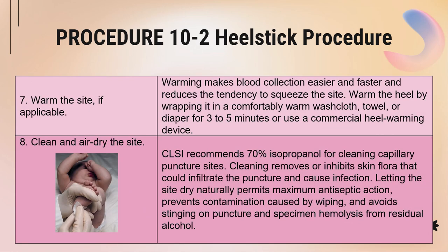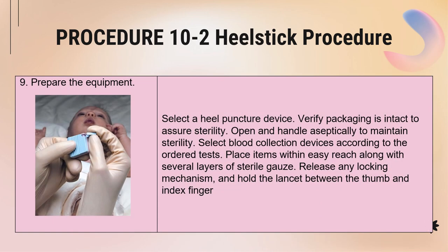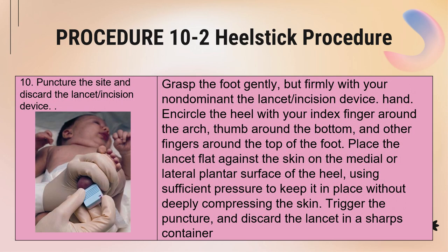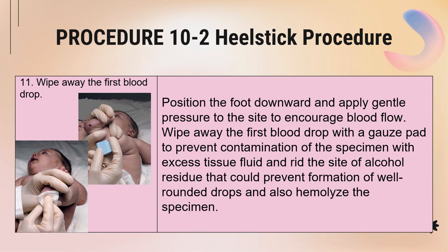7, warm the site. Again, using the warming device or comfortably warm washcloth. 8, clean and air dry the site. Okay, so 9, prepare the equipment. 10, puncture the site and discard the lancet incision device. 11, wipe away the first blood drop. And then take note of the picture on how the phlebotomist holds the heel or the foot of the baby. Okay.